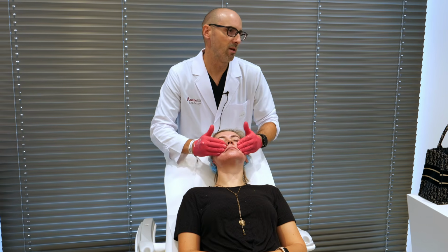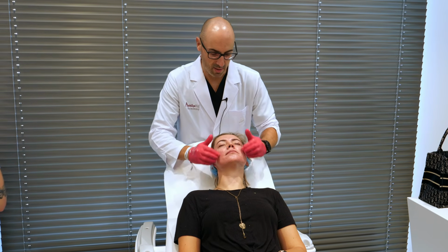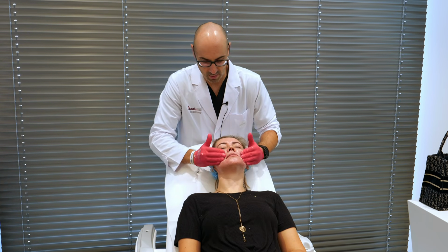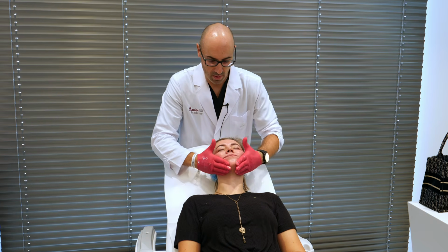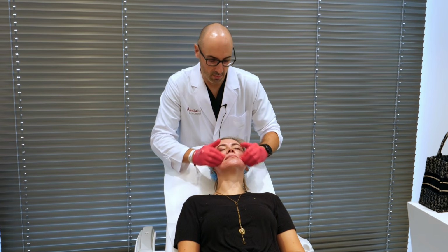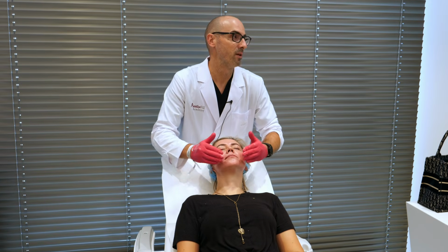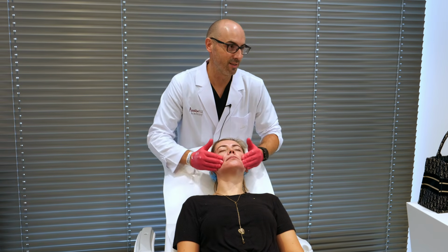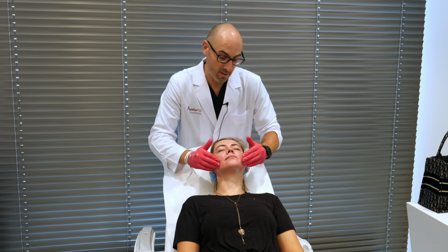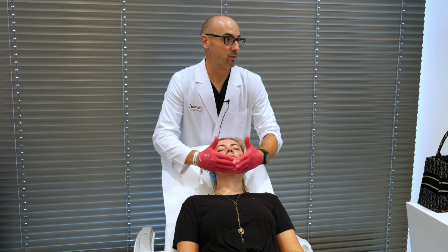I can see if I make lumps of the product in any zone, or if I make a lesion on a vessel, and prevent it by putting arnica in this zone. And the best is to give her a more comfortable finish of the treatment.